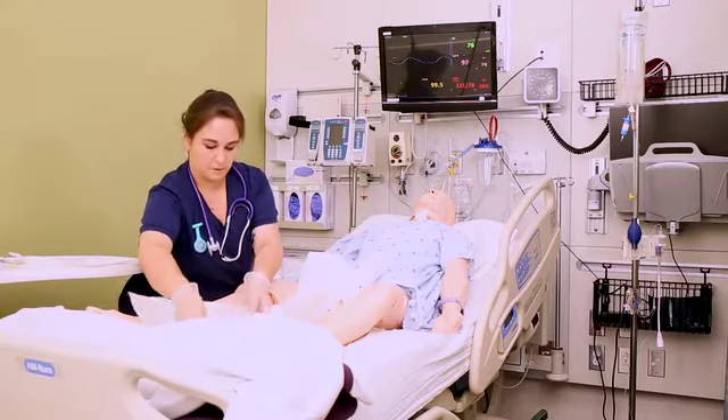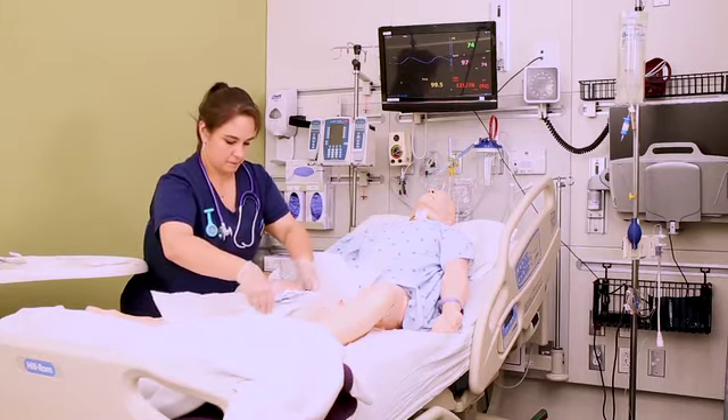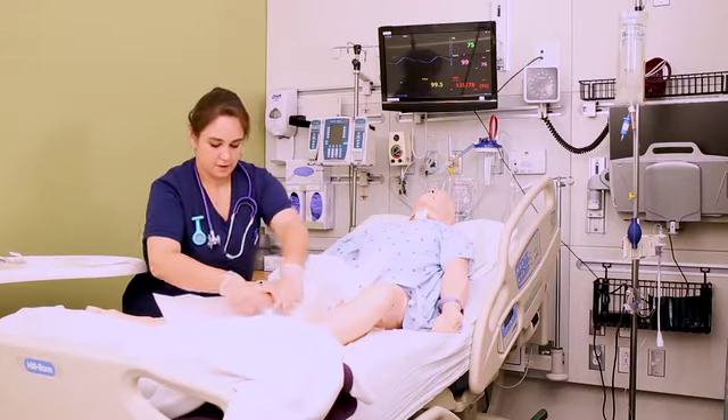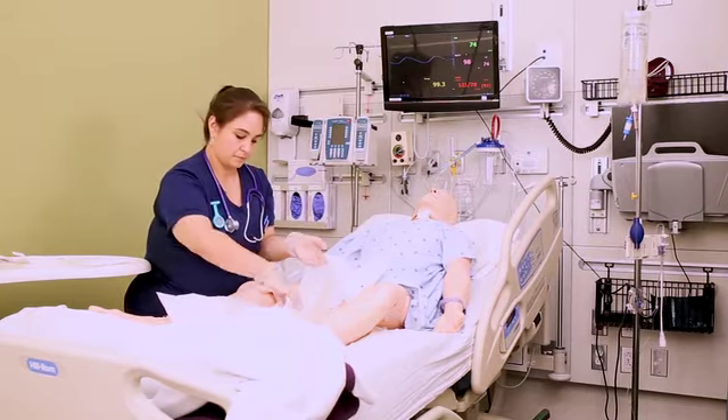Grab the plastic tray off the top of the kit, slide the kit towards the patient's feet, and pull the tray between the kit and the perineum — again just giving yourself a nice wide place to work from.